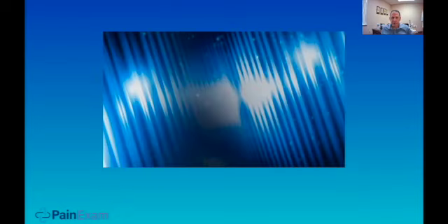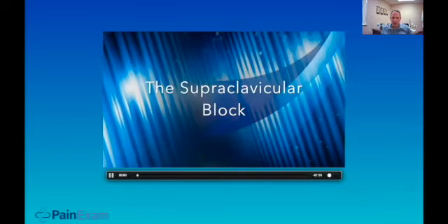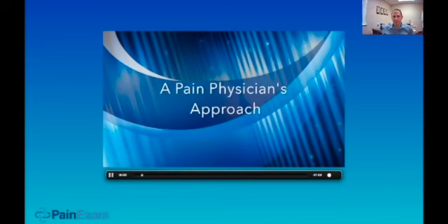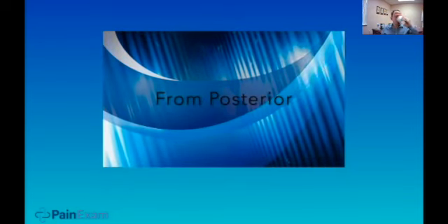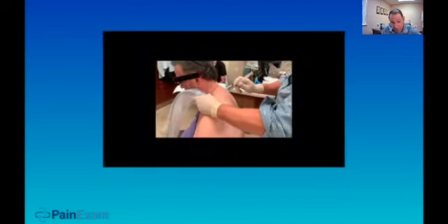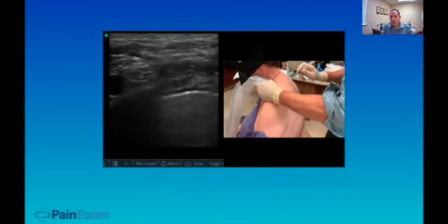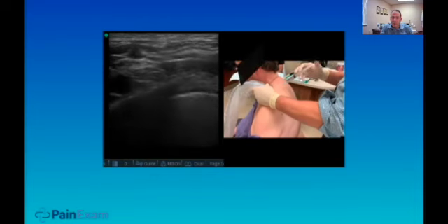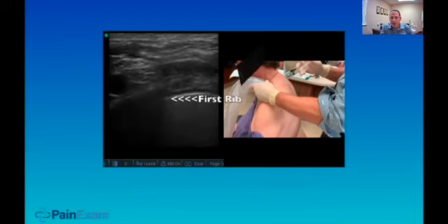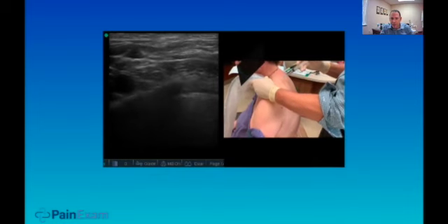And here's just a little video of how I do this in the pain office. This is not how we do it in the anesthesia world because my patient is sitting up. You could do it that way, but I caution you because I'm not giving large doses of local. So I wouldn't like to give him 20 mLs of bupivacaine and have him sit up for that. I would lie him down for that.